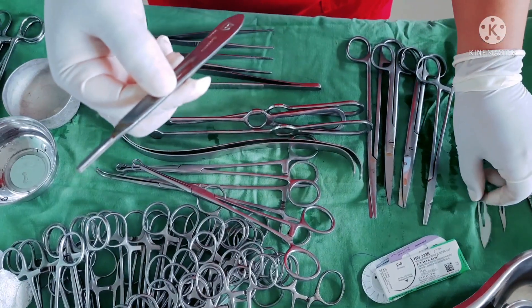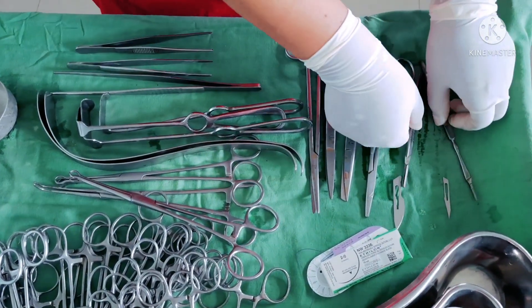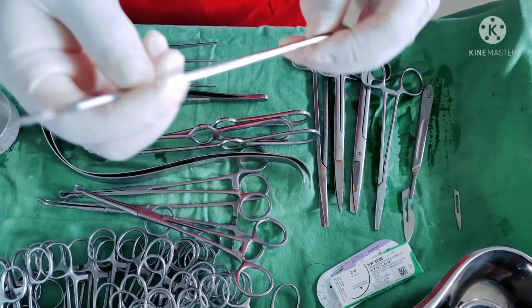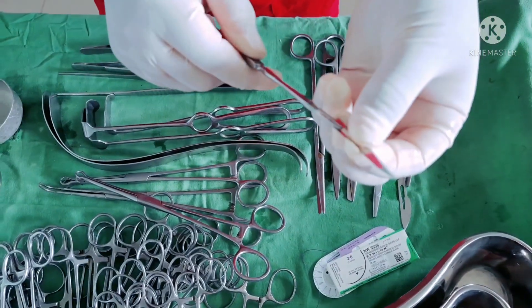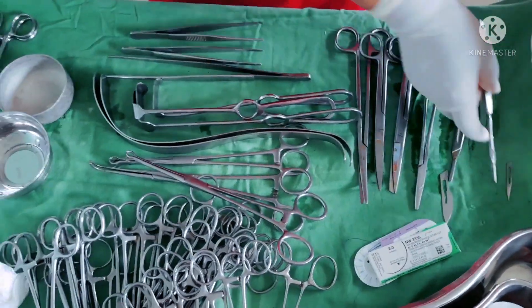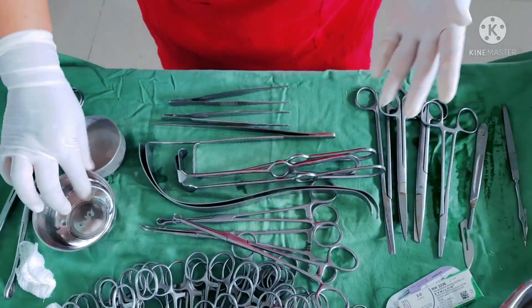This is number 4 scalpel handle, used to fix blades of number 20 and above. And this is another scalpel handle which can fix blades of number 15 and 11. I have here two gallipots — one for betadine and one for spirit solutions.